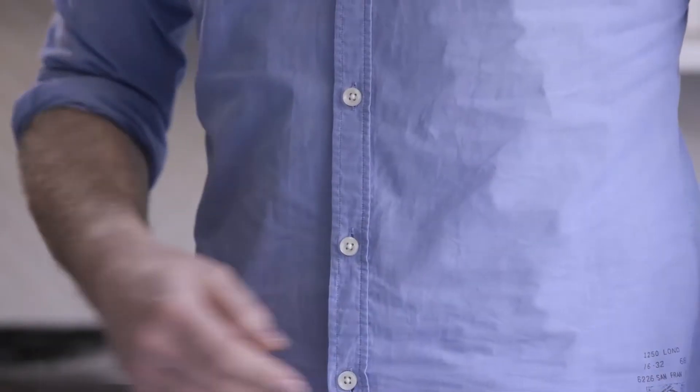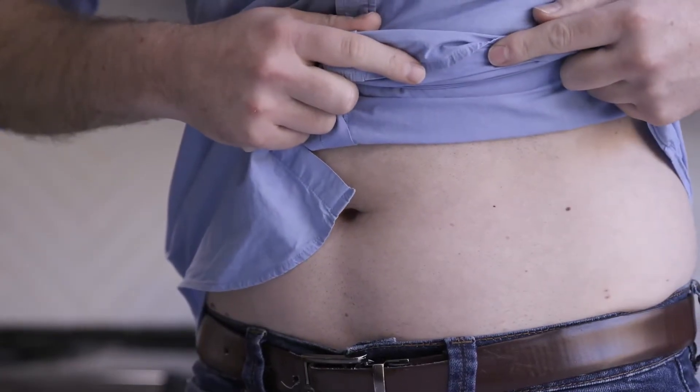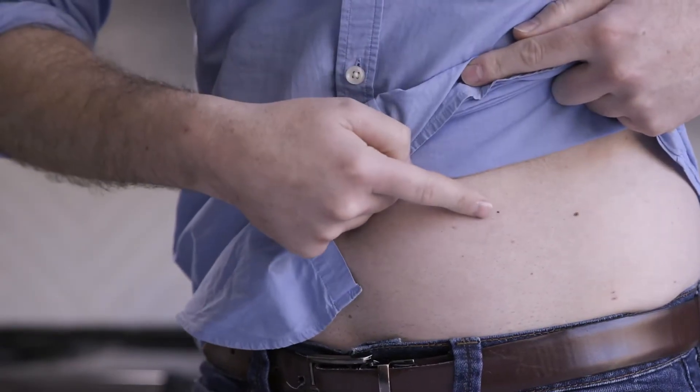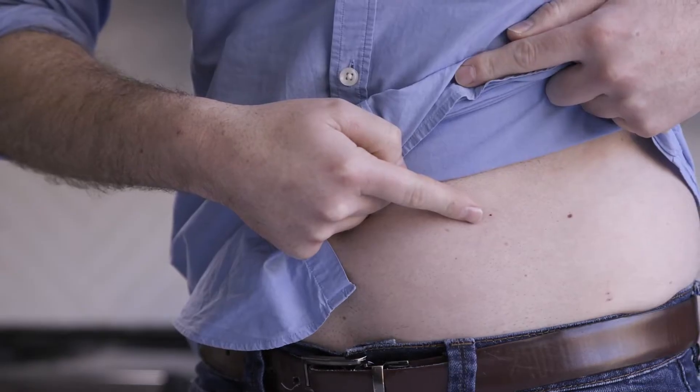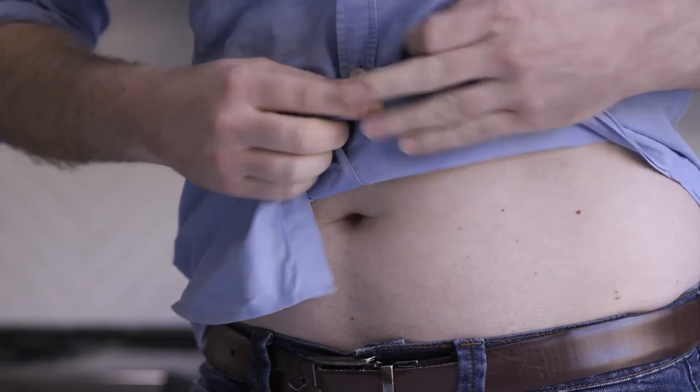To insert your sensor, choose a place on your belly or the back of your arm. If you are under 18, you have the option to place it on your upper buttocks as well. Avoid sites with irritated skin, bones, tattoos, or areas that get bumped.